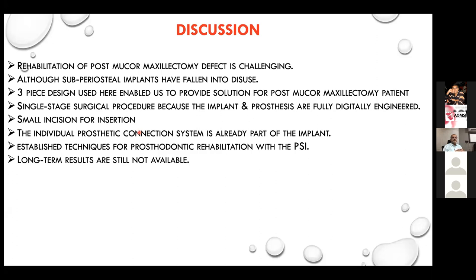Now this three-piece design reduces the exposure. You can discharge the patient, and you can do it as a daycare procedure. All the screws, including the zygoma, we place with the trocar. No extraoral incision was given in any patient, except for the case where there was an extension onto the zygomatic arch.